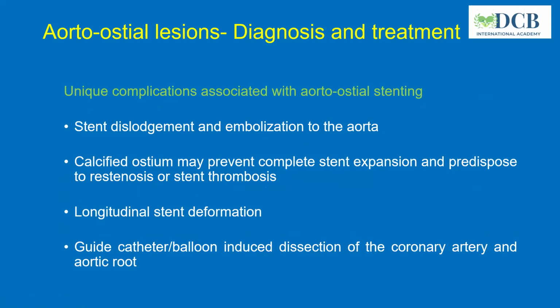The unique complications and challenges with aortic ostial stenting are stent dislodgement and stent embolization. Because of the calcium in the ostium, it may prevent complete stent expansion. There is also longitudinal stent deformation, and guide catheter or balloon induced dissection of the coronary artery, ostium, and aortic root.